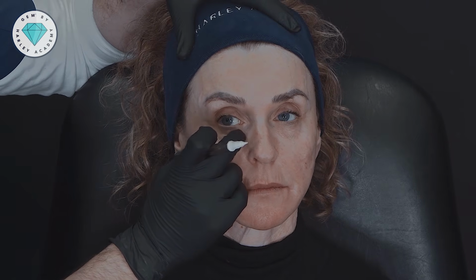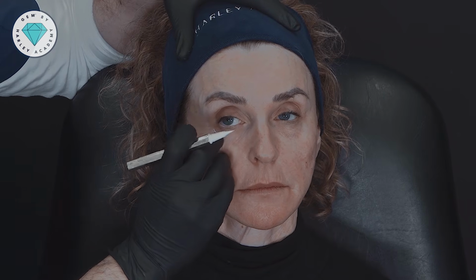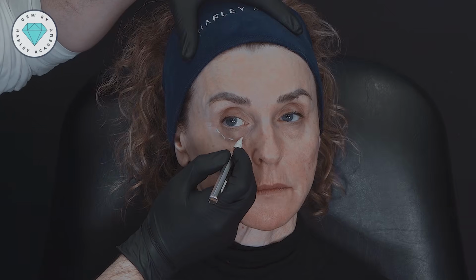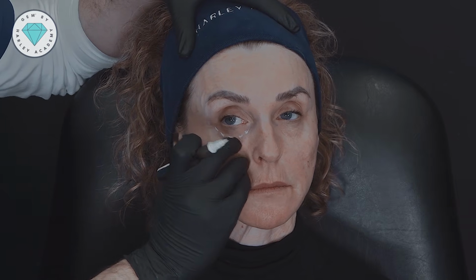When we treat the medial midface, the first thing I always do is I just find the inferior bony margin, and that becomes the highest point of any treatment that we would do in the midface. This is the origin of our orbicularis retaining ligaments, and we certainly shouldn't go above that margin. So anything above there is the eye, okay?